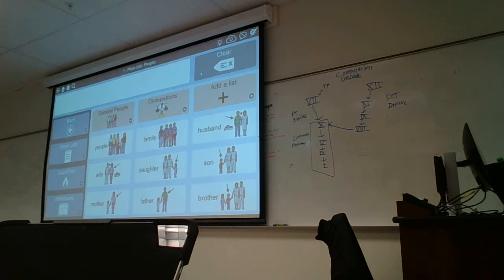Any questions so far about SnapCore? With the aphasia page set, I noticed the icons are not PCS, so they're different, yeah. So they're customized exactly for the aphasia page sets, to provide more information to the icons. So that's just something I picked up on.